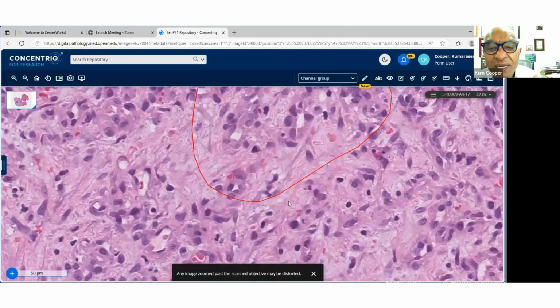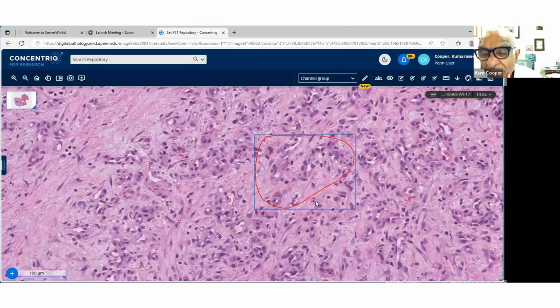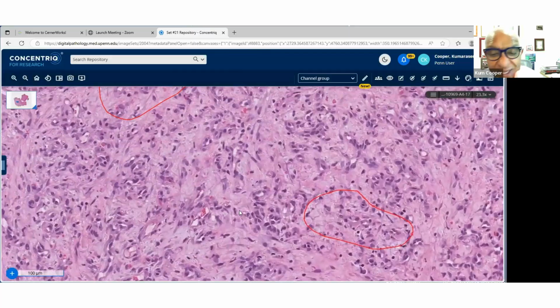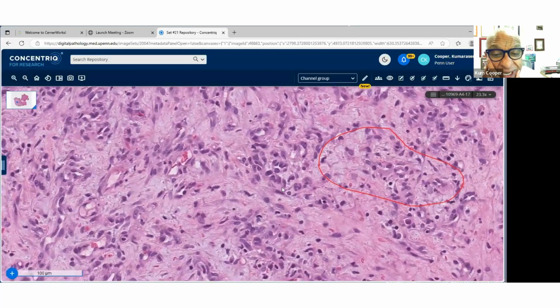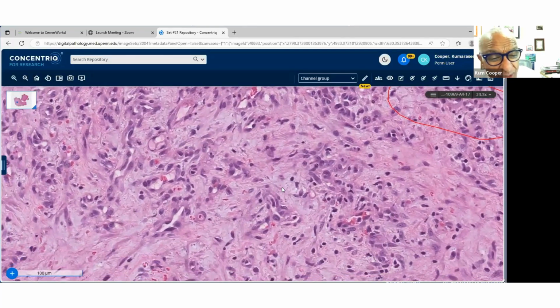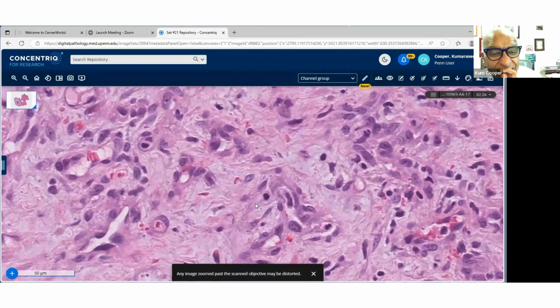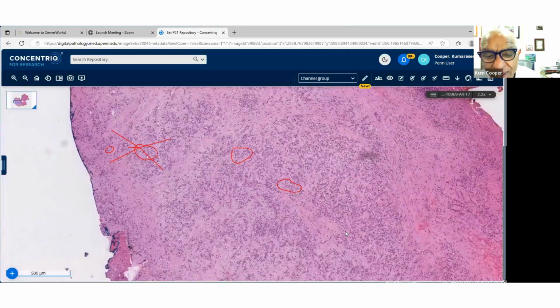Yeah, you can see it looking a little epithelioid, yeah? So forming a little lumen. So I can see why epithelioid hemangioma. Speaking of which, I think we have a nice one in the vertebral body with our fellow Brits. Anyway, a piece of information I'm holding back here is this patient had a renal transplant. Oh, we've got angiosarcoma. It doesn't look too ugly. Okay, I accept angiosarcoma, but it doesn't look ugly, and dare I say, somewhat lobulated as well.